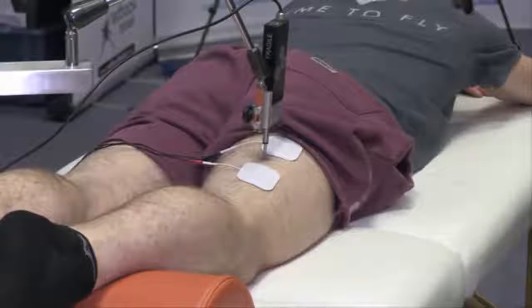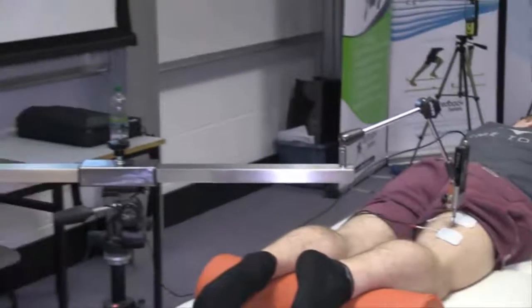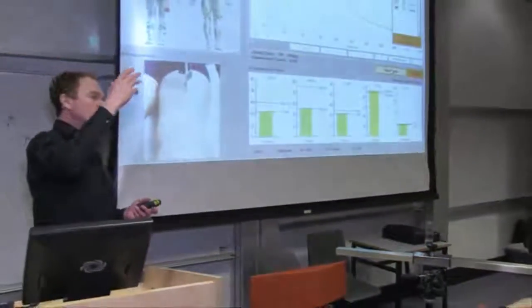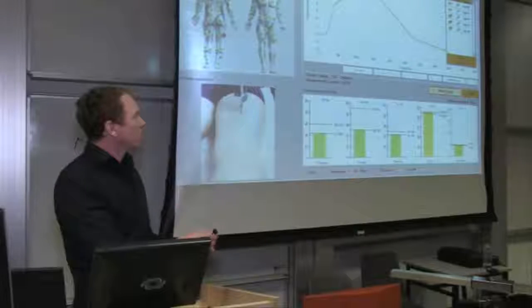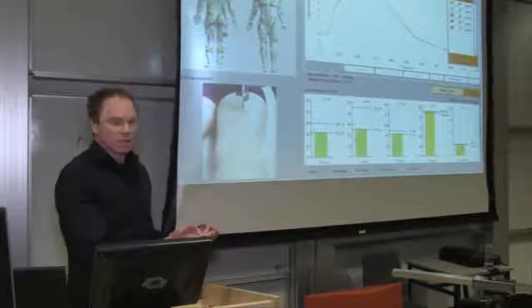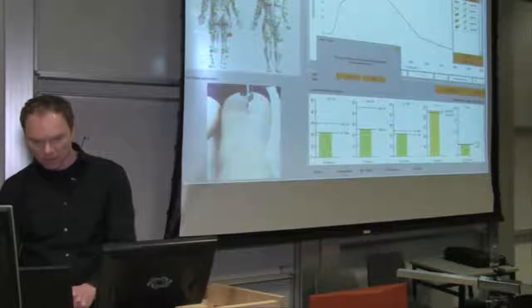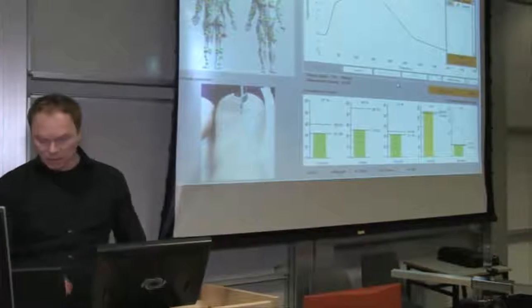Okay, so for the last three measurements, this first part was the same all the time. The second part continues to increase. That's the co-contraction from the semitendinosus muscles. So I'll just stick to the last measurement because it's very stable. I don't want to have the interference from the neighboring muscles. So I'm just saving this. Again, this muscle is quite fast.